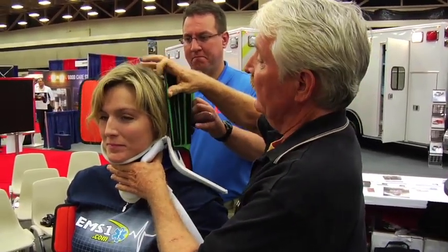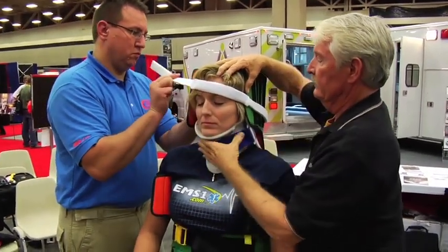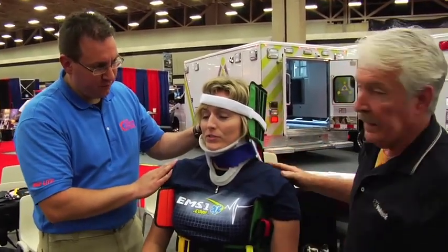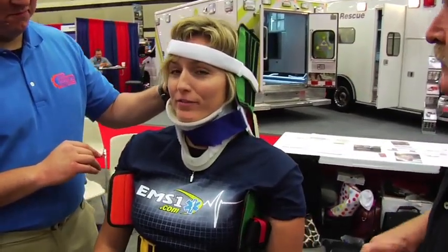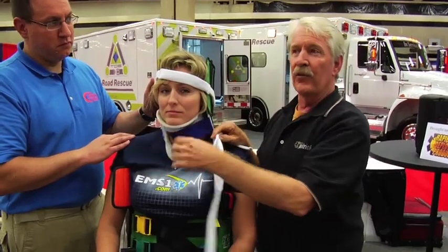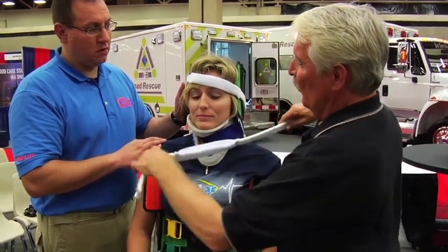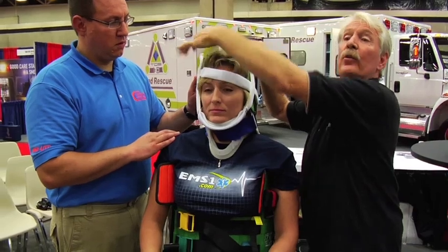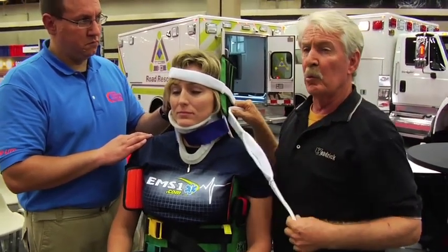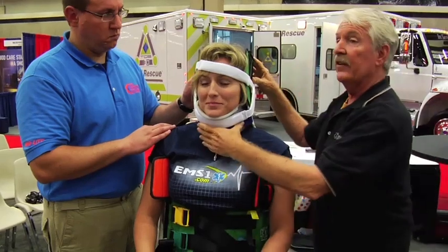Want to bring the flap around? Now, if you're using a cervical collar and it's on — and I'll still call this a chin strap — we quit doing chin straps because people were afraid that a patient who became ill and wanted to vomit wouldn't be able to get their mouth open. That's totally wrong. They used to put the chin strap on like this — yes, it would hold the mouth shut. But if you come back horizontal through the hinge of the mandible, they're going to be able to open their mouth. Also, if you're using a good stiff collar and it's on properly, you come around the collar and you're actually attaching the collar to the device.